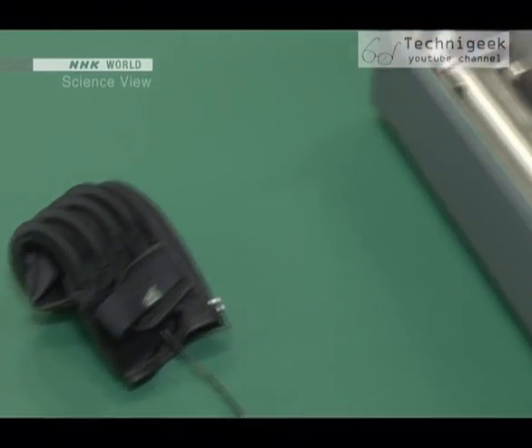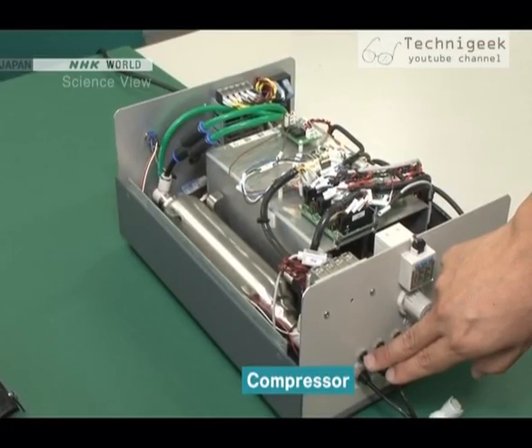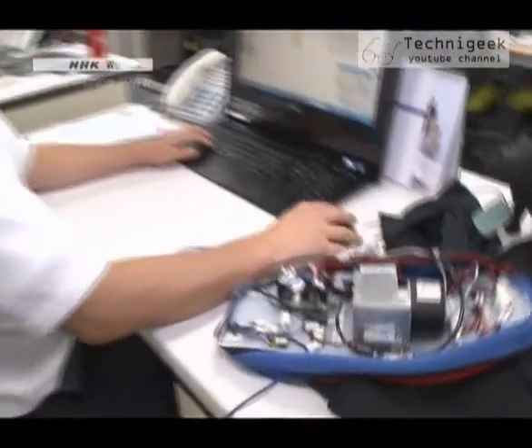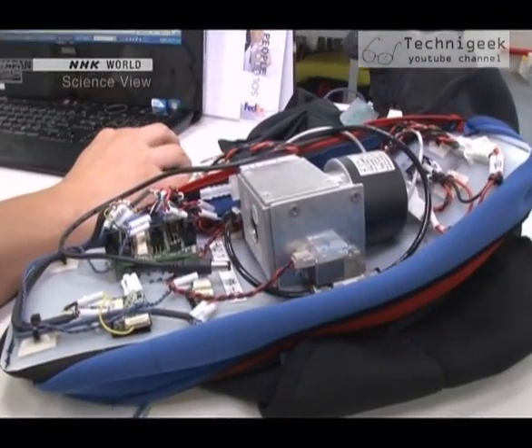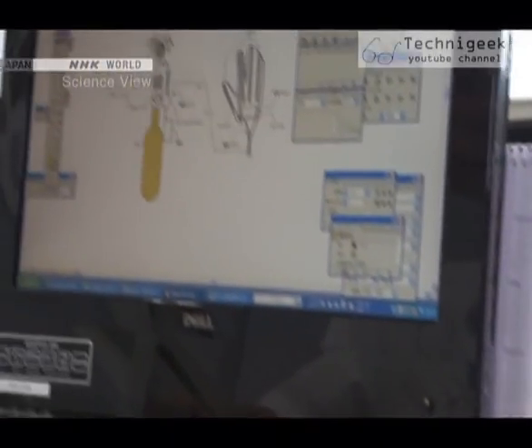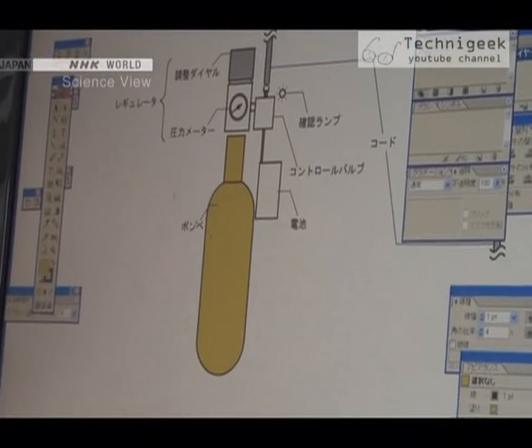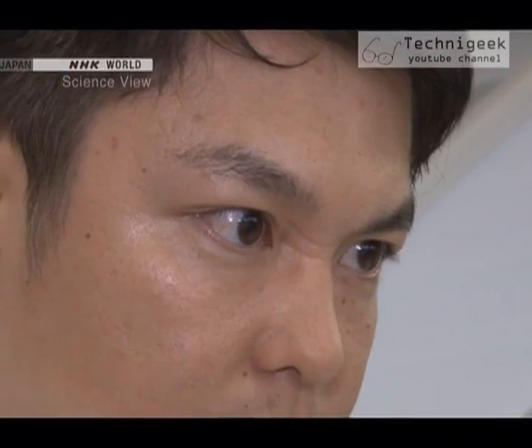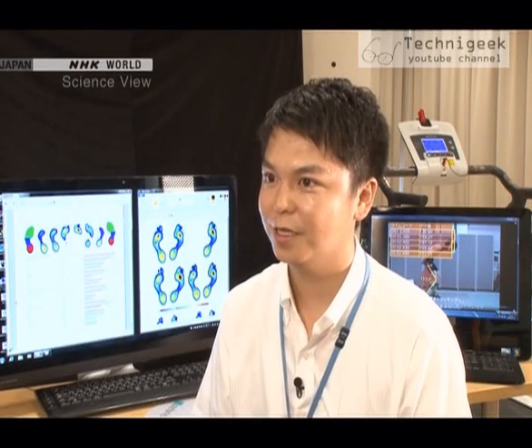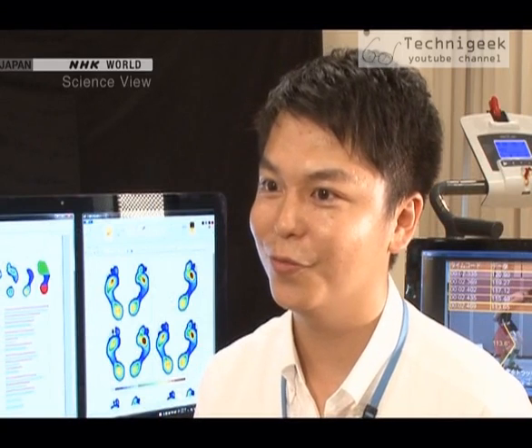The compressor that sent air to the artificial muscle was too bulky to be worn. He immediately worked on reducing the compressor's weight, but it had its limits. He then tried to reduce the weight by replacing the compressor with a compressed air cylinder. However, the amount of air in it was only enough for a few times. I tried making different prototypes and searched for a new solution. I believed there was a way.